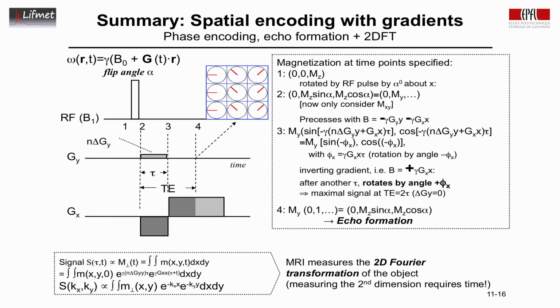So this is very complicated, I understand. So understanding phase encoding is not a very easy topic. We will try to rehash the process of phase encoding under a different perspective at the beginning of next week, to look at this with a slightly different optic so we can digest this better and understand how spatial information is being encoded.